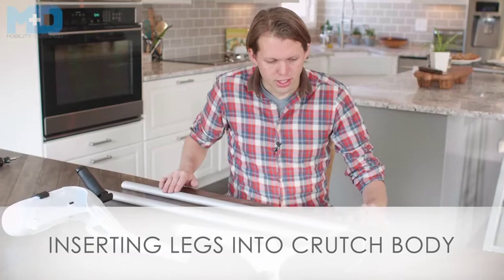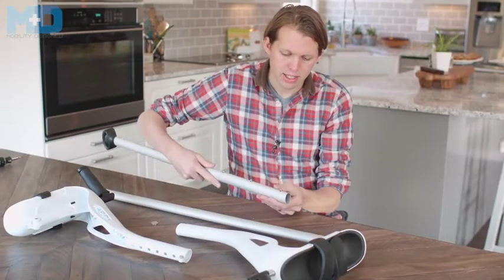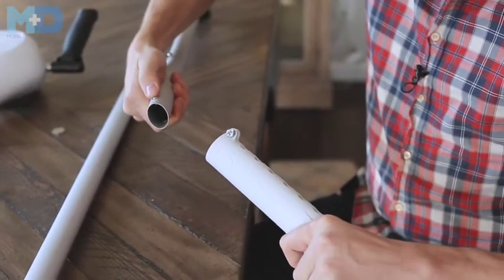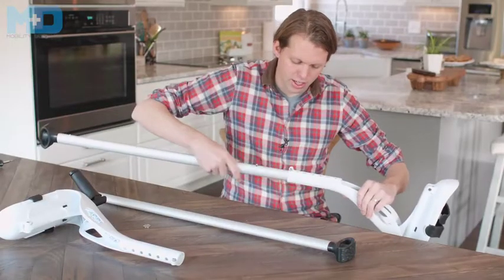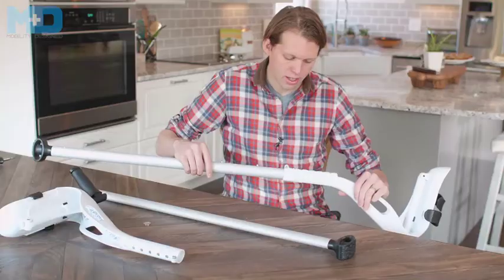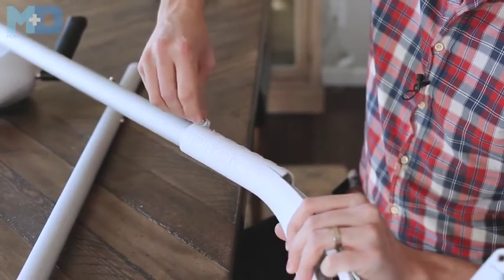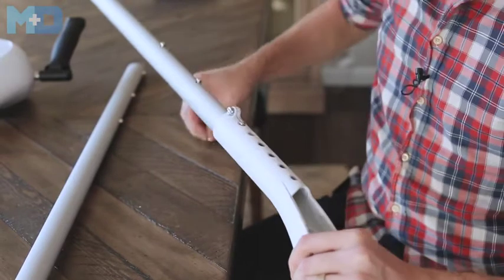After you've inserted both feet into the crutch legs, align the crutch leg to insert into the body. On the back of the crutch leg, there are three snap buttons that align with the three holes on the back of the crutch body. To insert the leg, depress the snap button and slide in the bottom of the crutch leg until you hear an audible click. When you walk, it can sometimes make a little noise, so we designed a tensioner to allow you to reduce or eliminate that noise. Finger tighten, or use a coin or screwdriver, until the noise is gone.